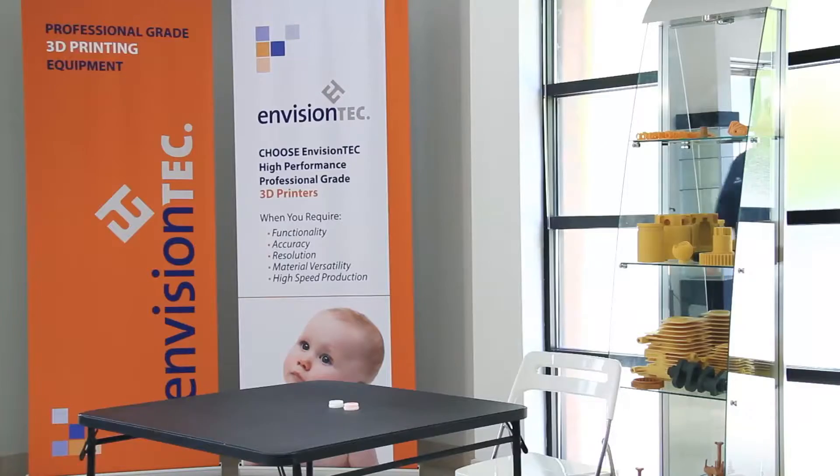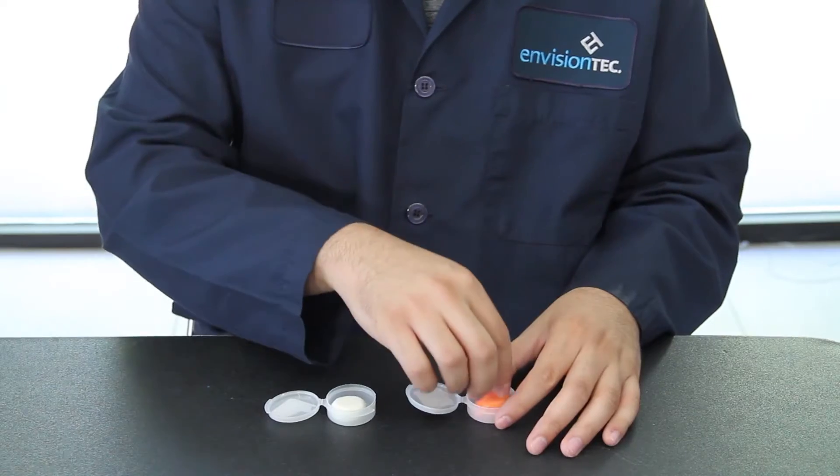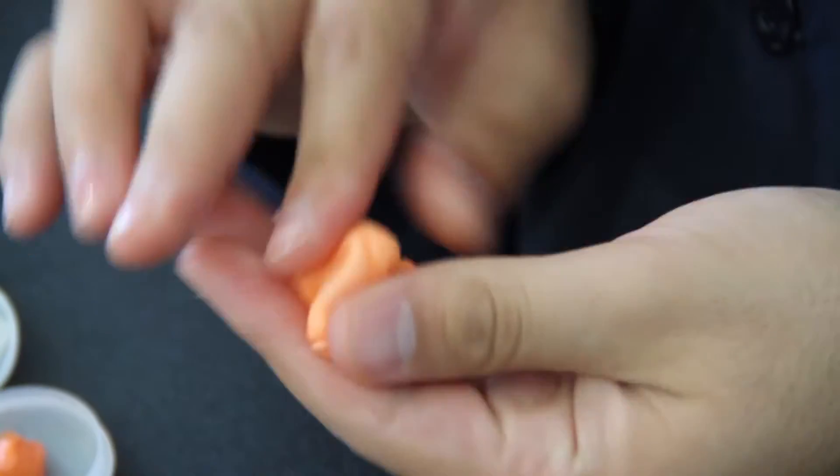Hi, my name is Miguel. In this tech tip, I will be demonstrating how to print custom fitted earphones on EnvisionTEC's digital desktop shell printer using E-Shell 450 resin.